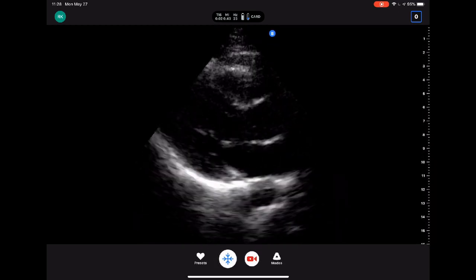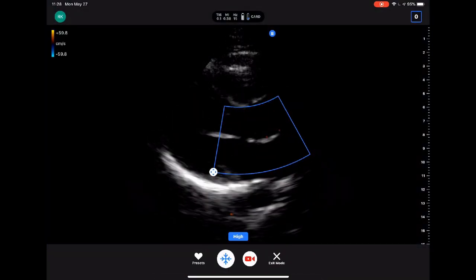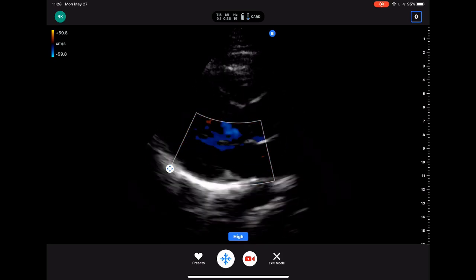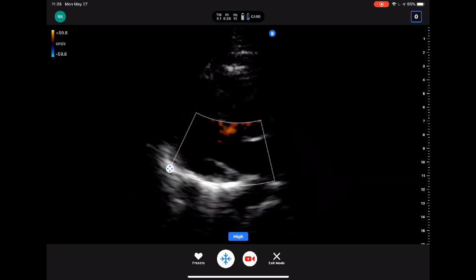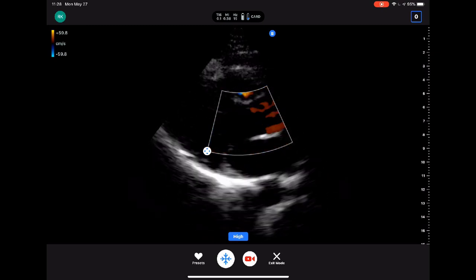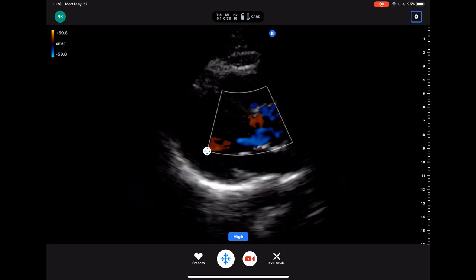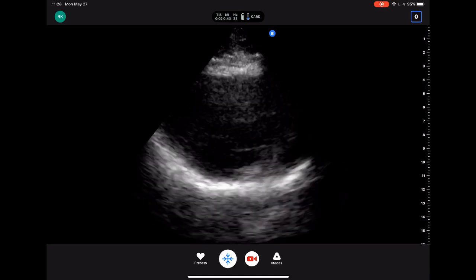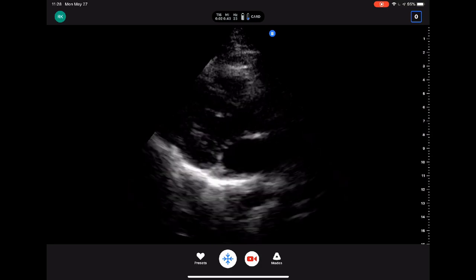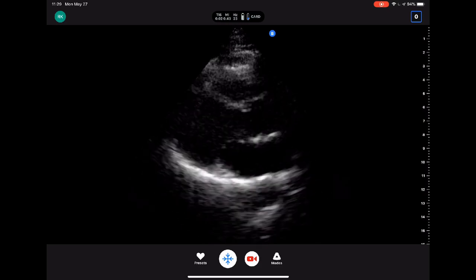Now let's get some color on here. You can adjust the color box just with a finger gesture like that. This is not the best view for color Doppler because you're perpendicular to the ultrasound beam, but nevertheless you can see how easy it is to manipulate things. So there's my right ventricular outflow tract on the top of the screen, mitral valve on the bottom, and you can even see my descending aorta at the very bottom. Bright pericardium.